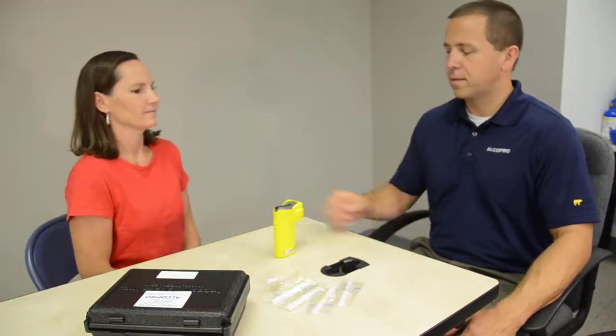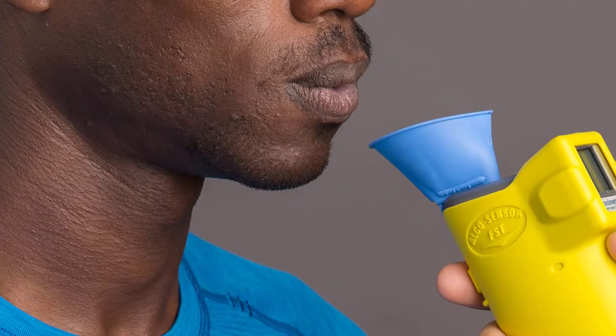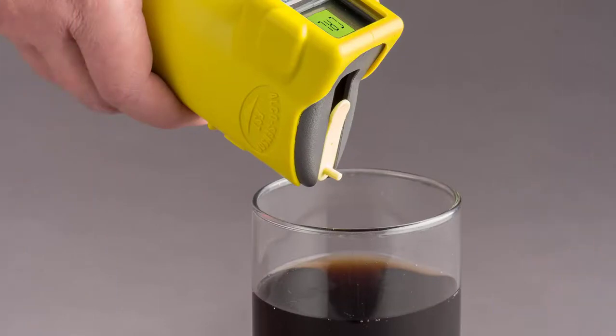Durable and easy to use, the AlkaSensor FST is designed to conduct a test using automatic or manual breath sampling and can perform passive alcohol testing on subjects. The device comes with a drink sniffer accessory that can be used to test beverages for the presence of alcohol.